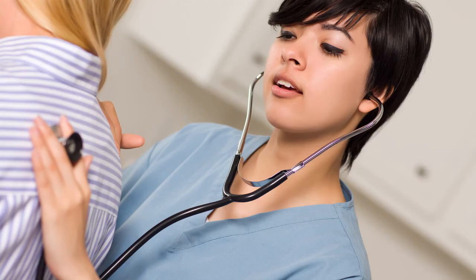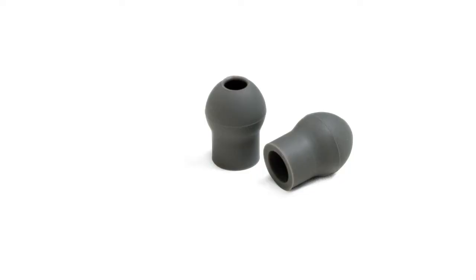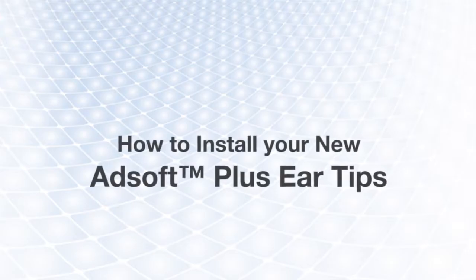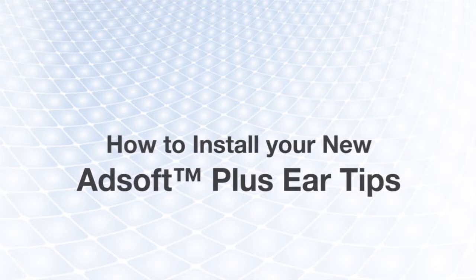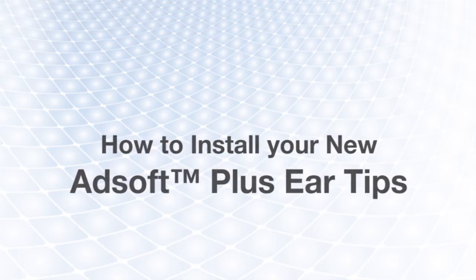ADC's new AdSoft Plus ear tips offer an improved acoustic seal and maximum comfort. Our new ear tips come standard with all new AdScope stethoscopes, but if you have an older AdScope, the new ear tips can be added using an adapter kit. In this video we'll show you how to attach the new ear tips to your previous generation stethoscope.